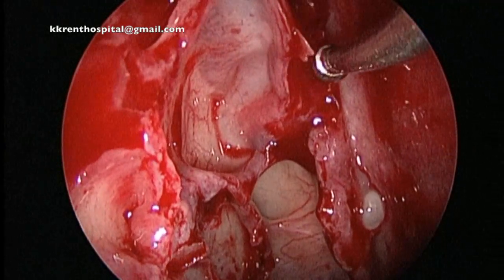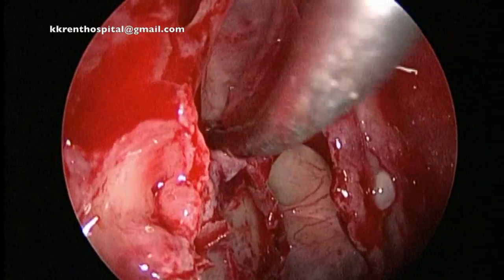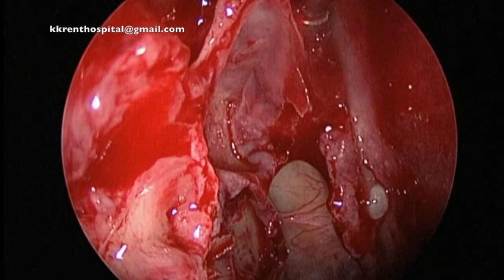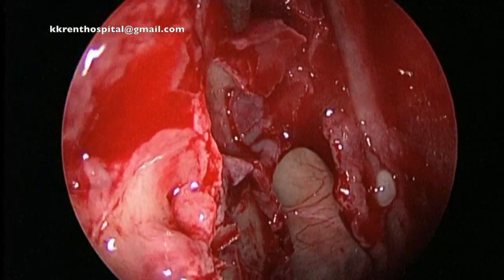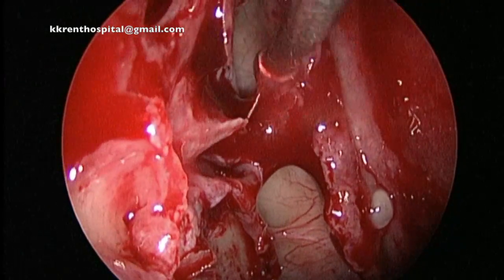The ball probe is palpating the cell, and that is what we call the uncapping of the egg. The cell protruding into the frontal sinus is being removed.